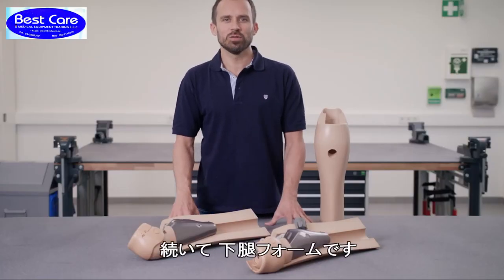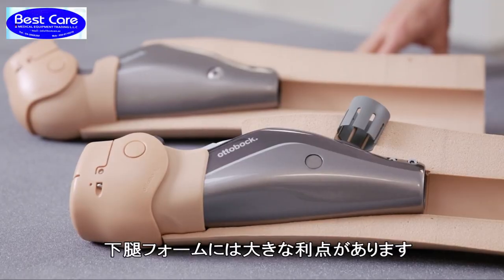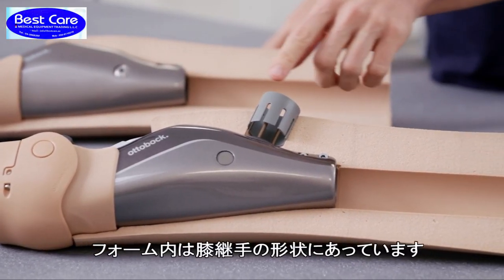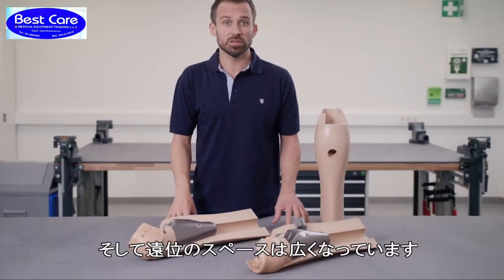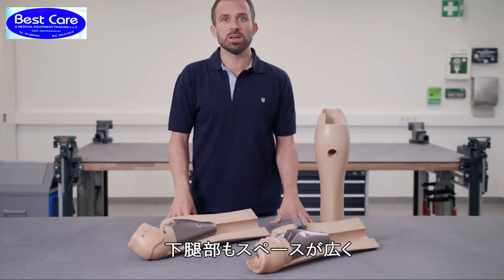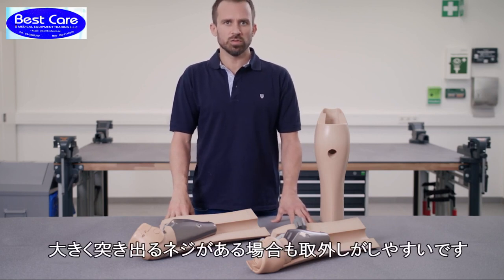Now let's move on to the functional shank. The shank offers a significant advantage — the contours of the knee joints are integrated precisely into the shanks. The shank part also has a large hole, which makes it easier to pull it on and off if there are screws that protrude significantly due to the construction.